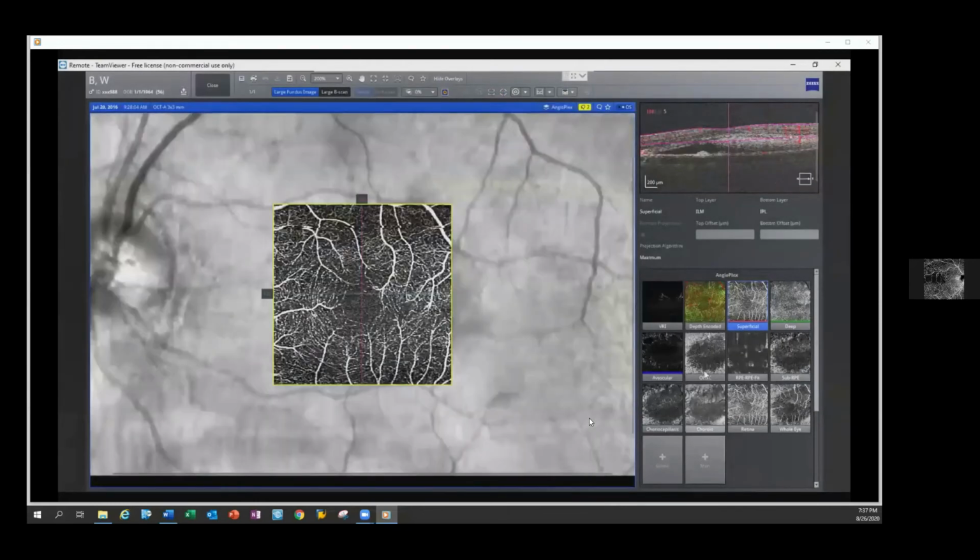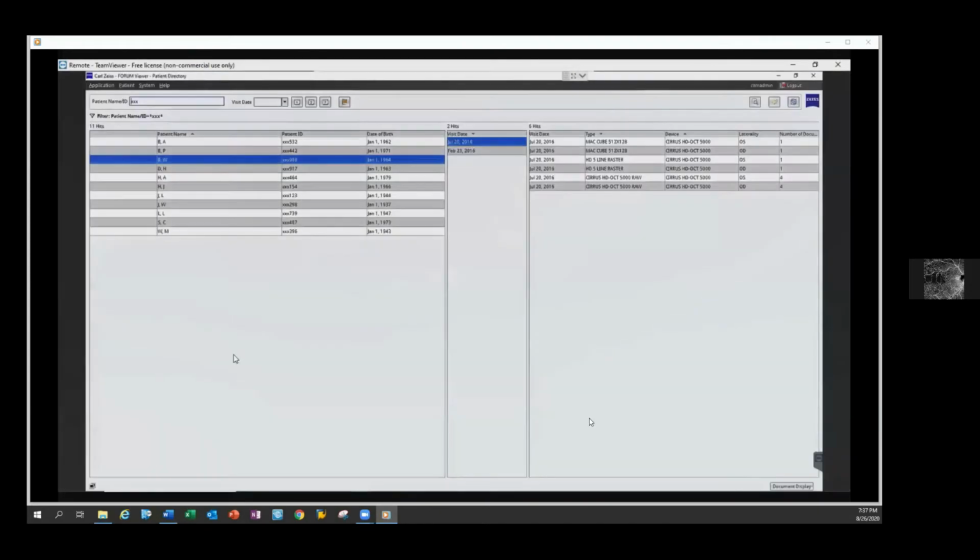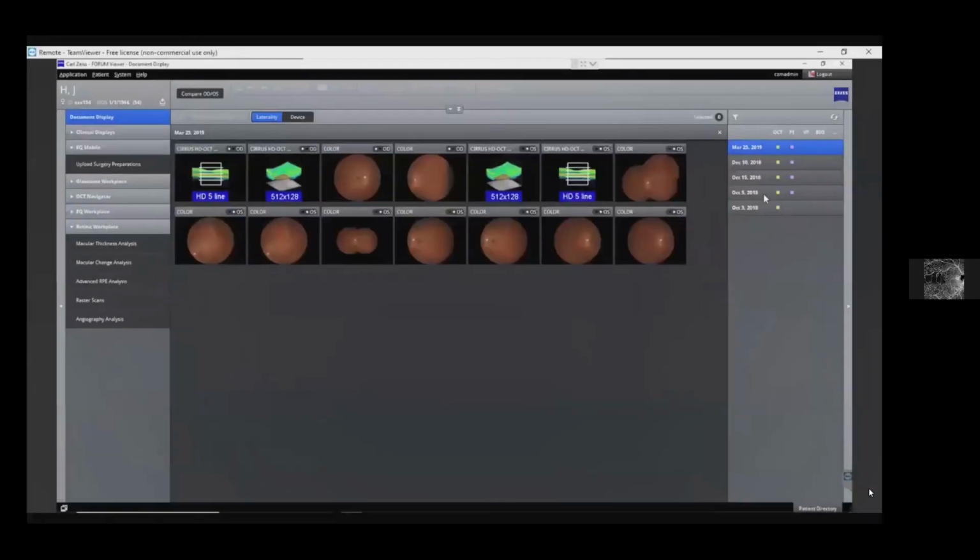You can see that the other eye does not have any evidence of CNV, and this eye was just observed. So again, a nice way to show the complementary nature of traditional angiography and OCTA. And now we can move on to patient HJ, our final multimodal overlay example.